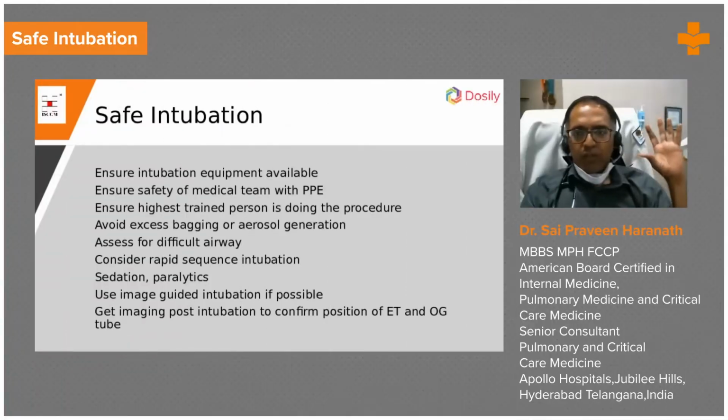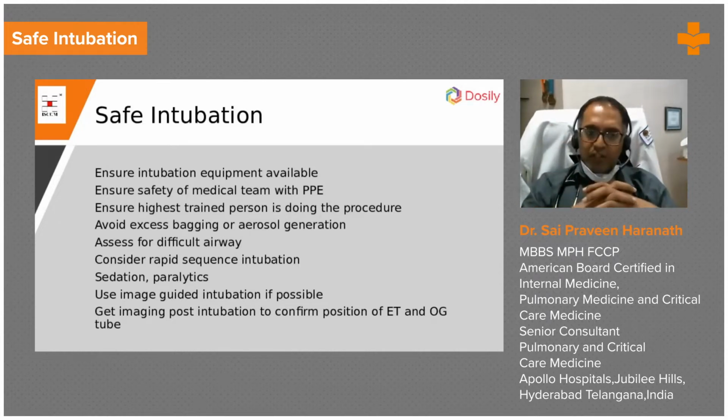Talk about safe intubation. You want to ensure that your intubation equipment is available, ensure that there is safety of your medical team with personal equipment for protection. Also, make sure the highest trained person is doing the procedure. Avoid excess bagging or aerosol generation.